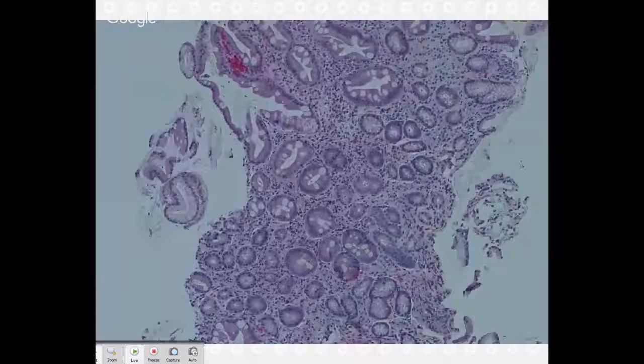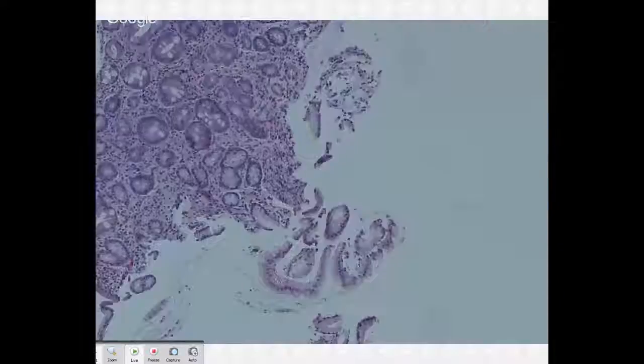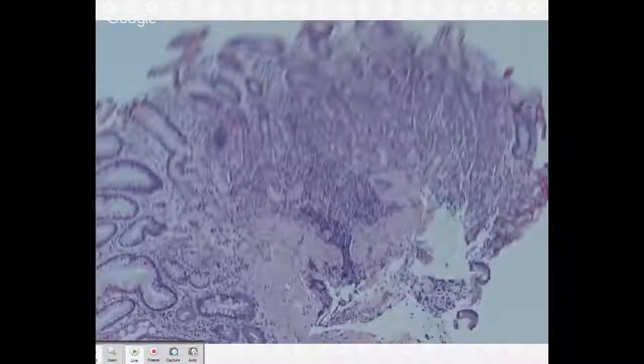How could you tell? This is a good question. If you got this and they just say stomach, I think this looks like autoimmune gastritis, but I know that that should impact my body and fundus and not my antrum. But this all looks like antrum. How could you know? What's a stain you could do to determine if you're looking at antrum versus body fundus? Gastrin, right. If gastrin's negative, you know you're in body fundus, because you only have G cells in your antrum.